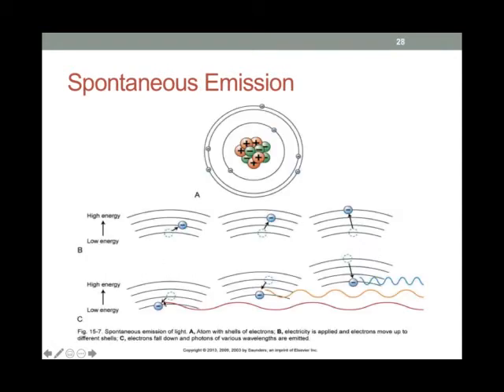All right. So it's just looking like this, where you have the pumping. So we're pumping energy into the area, exciting the electron. The electron spontaneously emits a photon and drops back down to its resting state. That photon will travel and hit another electron that's excited, and that will stimulate the emission of a second photon. So now those two are traveling back and forth, and then that just occurs with each excited electron that those photons will hit.